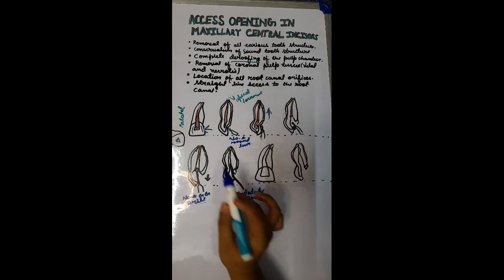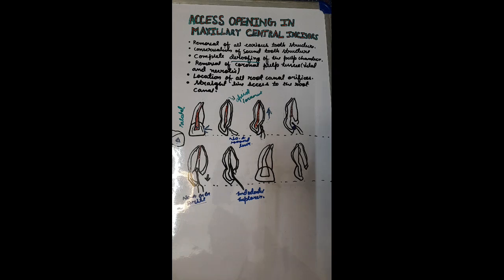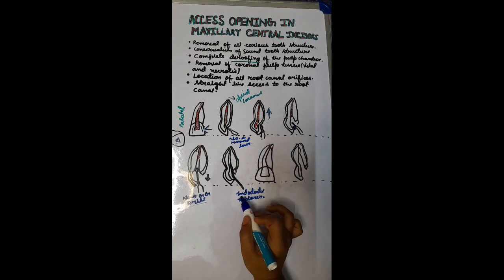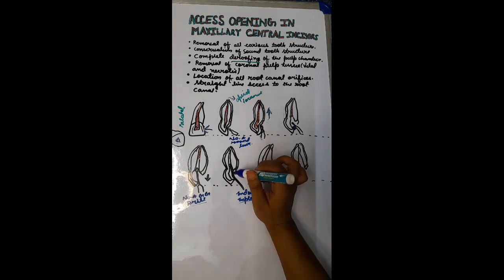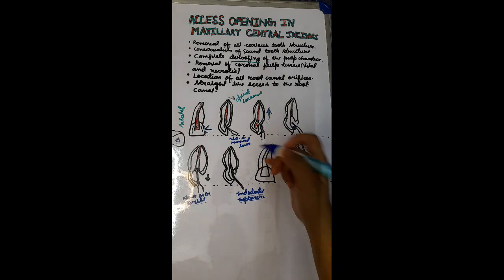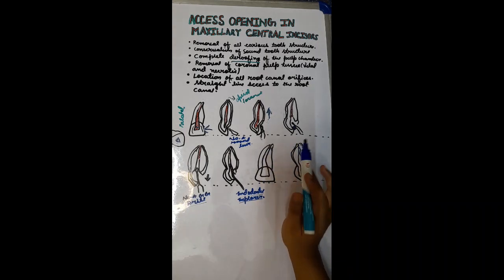And once the complete removal of the necrotic and vital pulp structure has happened, we will gain direct access up to the apical foramen from the endodontic explorer. We will use an endodontic explorer to gain straight line access up to the root canal, up to the apical foramen. And this is the complete removal of the pulp structure from the coronal and radicular portion of the tooth.